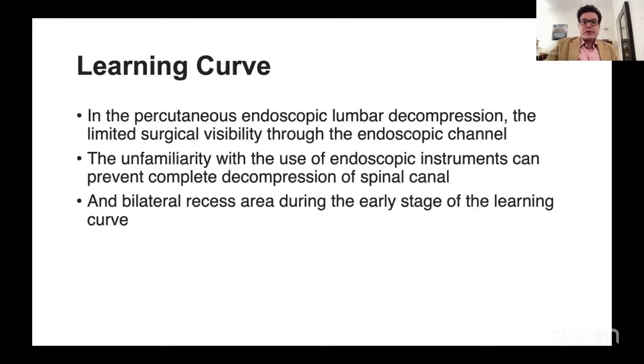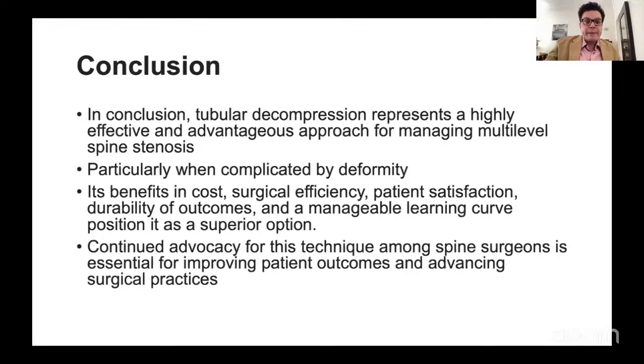In percutaneous endoscopic decompression, limited surgical visibility through the endoscopic channel, with the unfamiliarity of the endoscopic anatomy and the instrument handling, can cause the learning curve to be longer and increase the risk of complications, especially in the beginning of the learning curve of the surgeon.